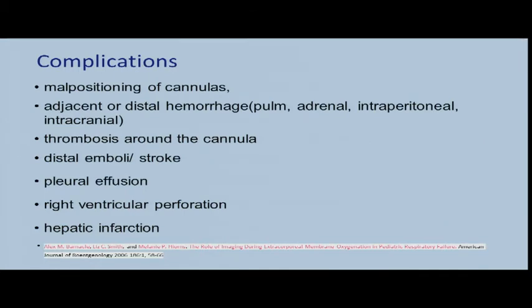Pleural effusion, right ventricular perforation. So like the bicaval cannula that we saw, the tip is meant to be in the IVC, but if it's not positioned properly and then you push in, it can actually perforate the right ventricle. And then hepatic infarction.